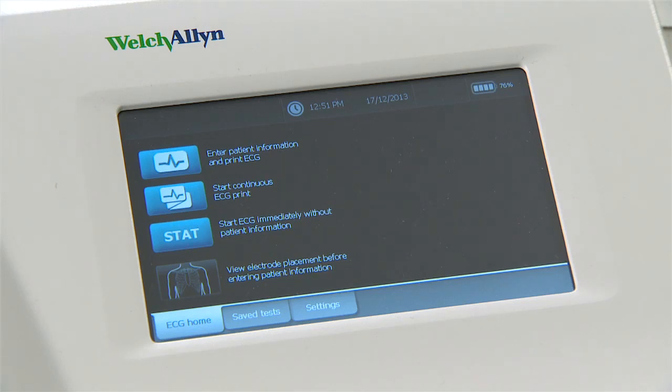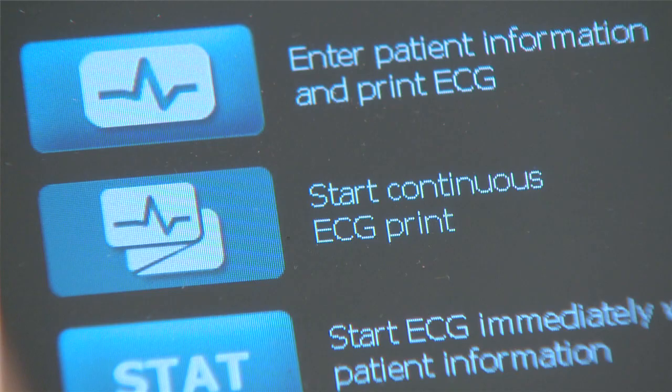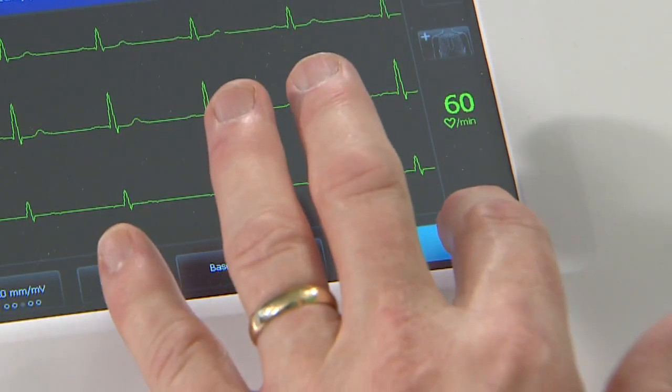If you ever need to take a rhythm ECG, select 'Start Continuous Print' on the home screen followed by start, and when you want to stop the test touch the stop button.